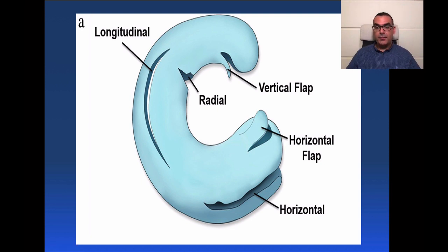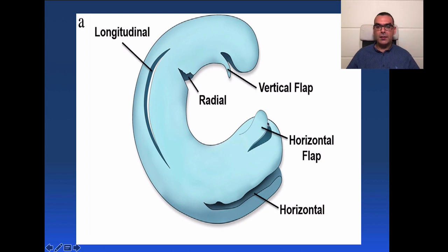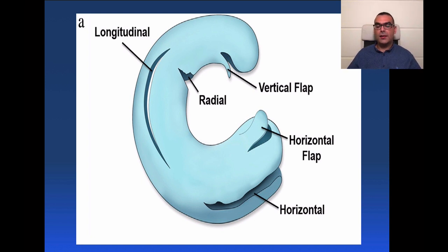There are also tears with displaced fragments. The two main types are vertical flap and horizontal flap tears. A horizontal flap tear is a horizontal tear close to one surface — superior or inferior — resulting in an amputated part that is flipped to the side. You get a defect in the meniscal girth and a meniscal fragment displaced either to the center of the joint, beneath the meniscal-capsular attachment, or beneath a collateral ligament.